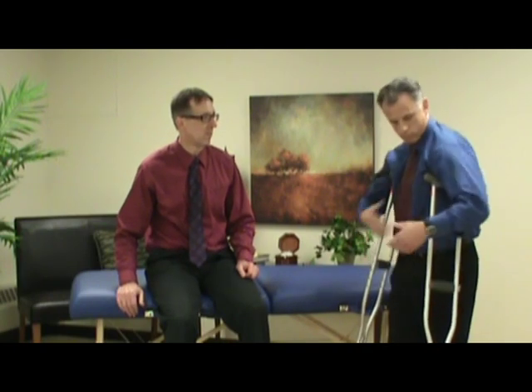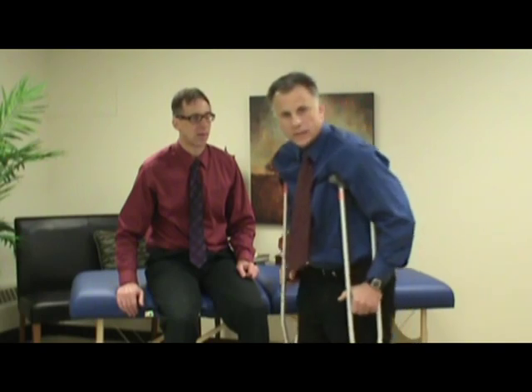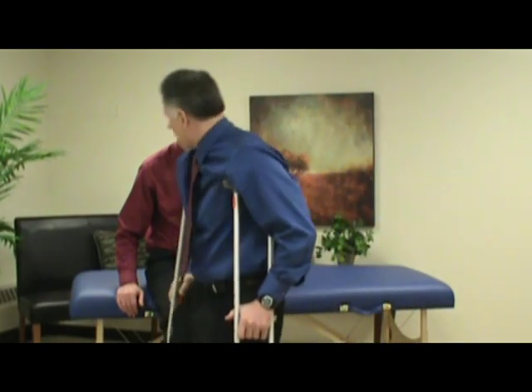On the other hand, either extreme is bad. If you're going too high, then what we're looking at is compression. Under the arm, you have nerve, artery, and veins that are running through here, and you can actually compress those. In theory, you could cause some damage, but at the very least, it's going to be very uncomfortable. I used to think you bear your weight through your shoulders, and that made sense to me.